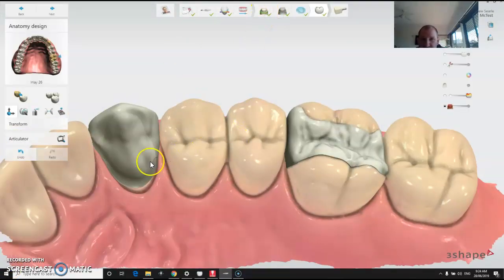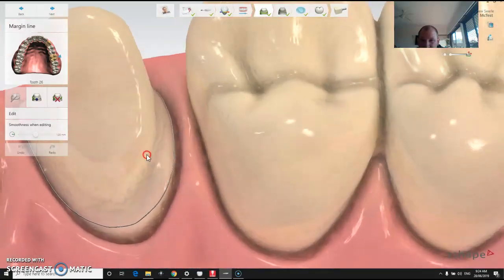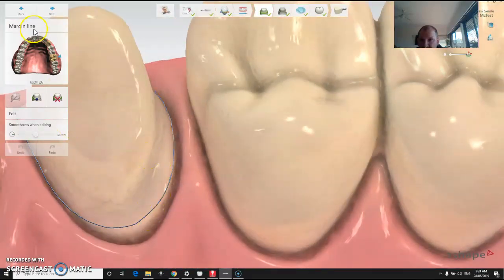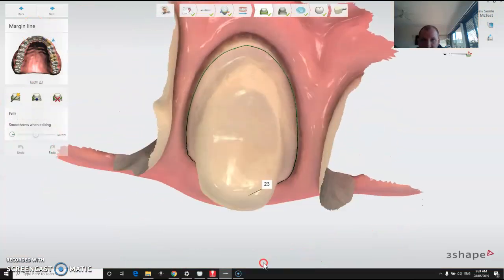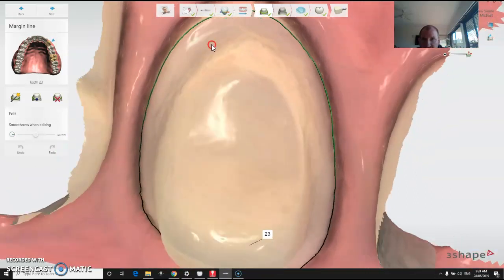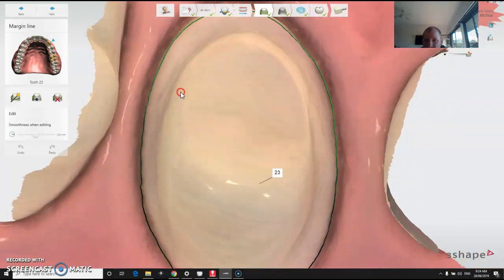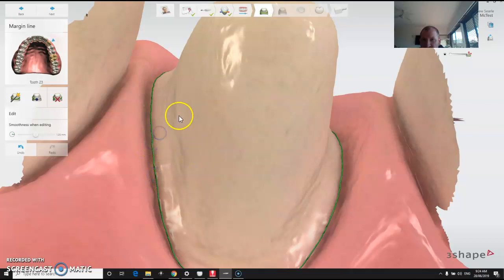After you've done your scan — I've already semi-designed these here — the next step is the margin tab, where you start drawing your margin. You can adjust it depending on what tooth you've got highlighted, to make sure your margin's correct. It will try to auto-detect the margin, and if it doesn't have any luck, you can manually go around and fix bits and pieces of the margin.